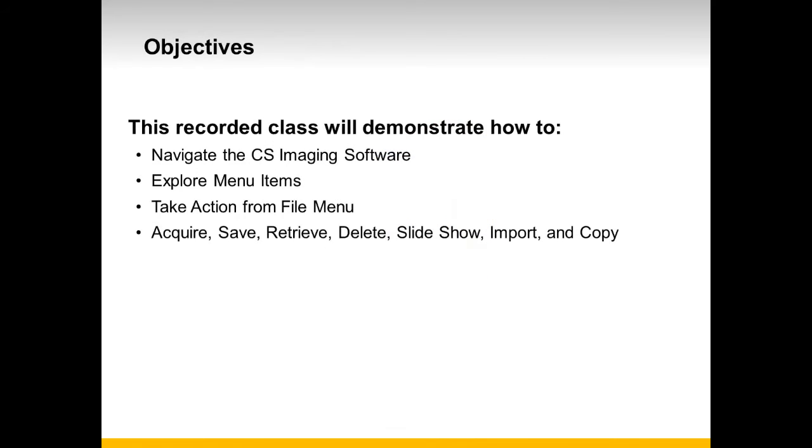During this recorded class, we will demonstrate how to navigate the software, explore menu items, and take action from menu items, such as acquiring, saving, retrieving, deleting, utilizing the slideshow feature, importing, and copying.